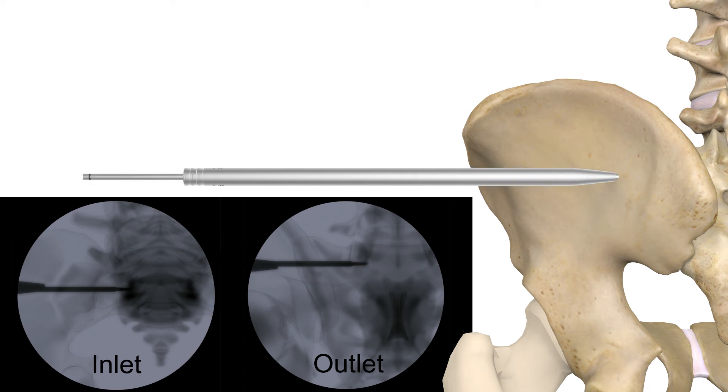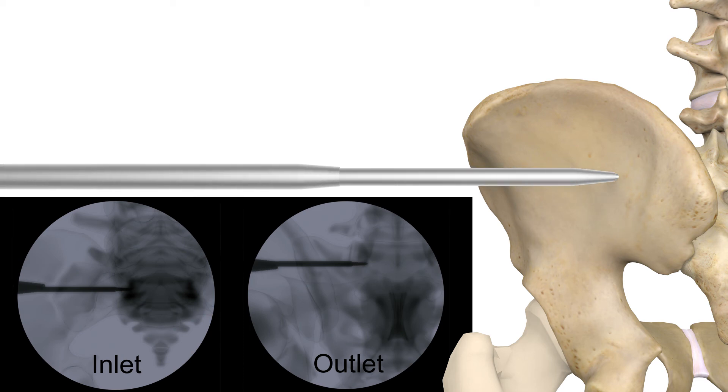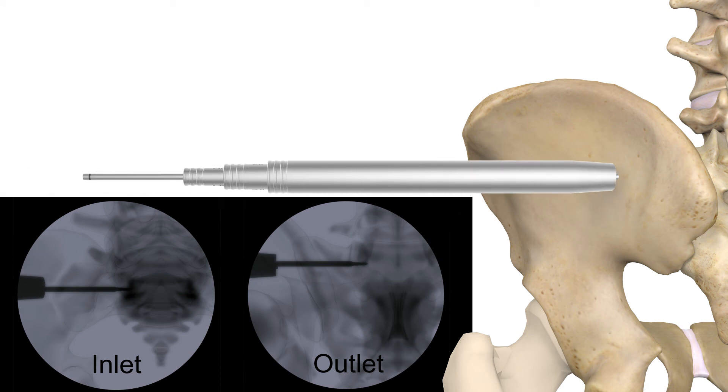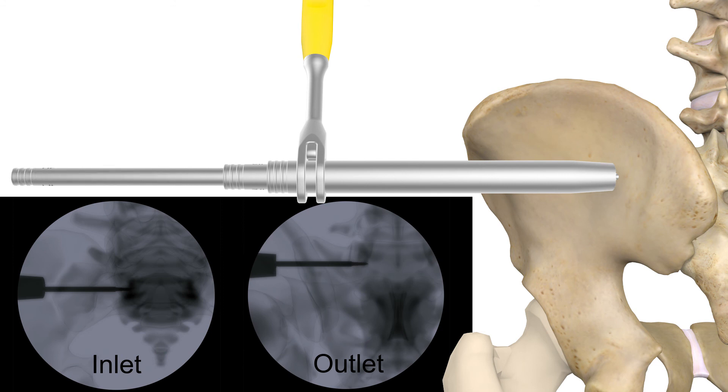Small, medium, and large dilators are used to sequentially dilate the incision site. The dilator handle is placed onto the third dilator just below the proximal ridges and two-finger tightened from the bottom of the handle. A plastic tissue shield can replace dilator 1 to test for nerve impedance. Then the first two dilators can be removed.